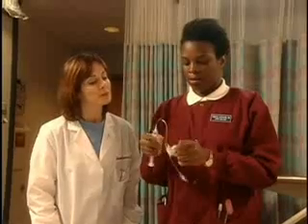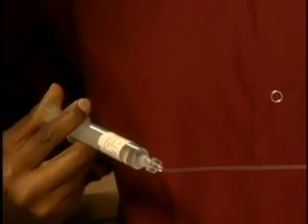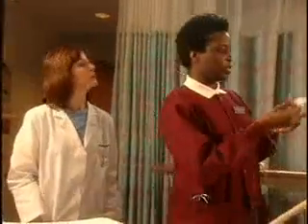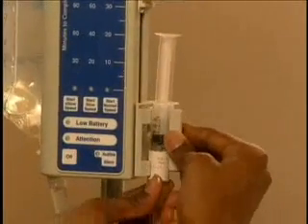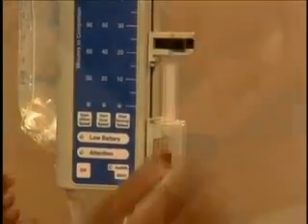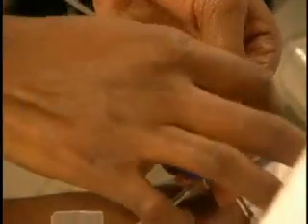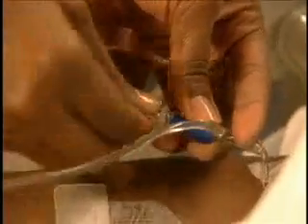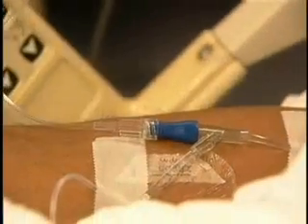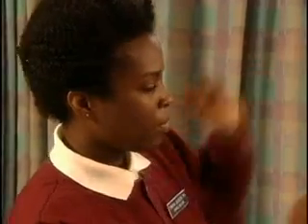Nicely done. And fill the tubing with medication solution by firmly pressing against the syringe plunger. There you go. Now, I'm inserting the syringe into the mini infusion pump with the flange of the syringe in the clamp's groove. Now use an alcohol swab to clean the medication administration port on the primary infusion tubing closest to the patient and connect the mini infusion tubing. With that done, I program the pump to the correct rate, in this case over half an hour, and press start.